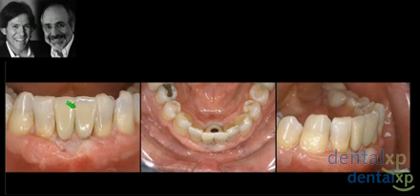So it's one implant placed down the center, biomechanically much better. Also from an aesthetic standpoint, obviously there just simply wasn't enough room. You can see clearly on the middle slide, just not enough room to place two implants. And rather than offset one implant, try to create an ovate pontic, placing one implant down the center and then building up the papilla may be a very, very effective alternative option.